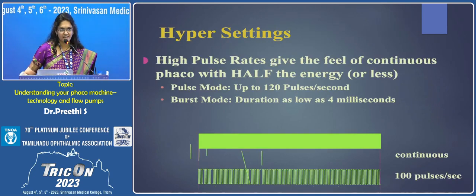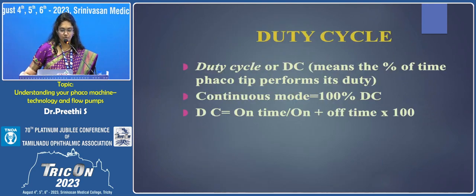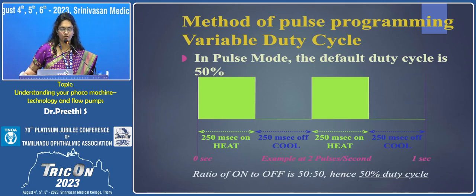I'm just telling the names. I think there's a talk which will elaborate this further. So this is hyper pulse rate, wherein you will have almost like a continuous power, which is 100 pulses per second. And duty cycle is how much time the phaco energy is on and off.